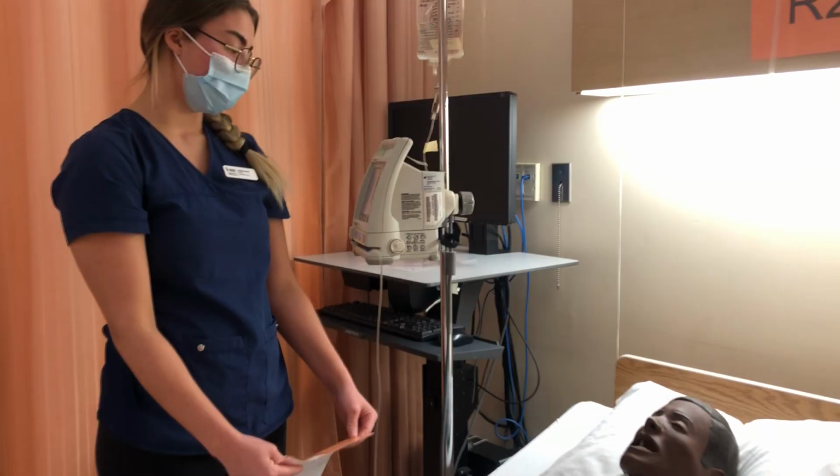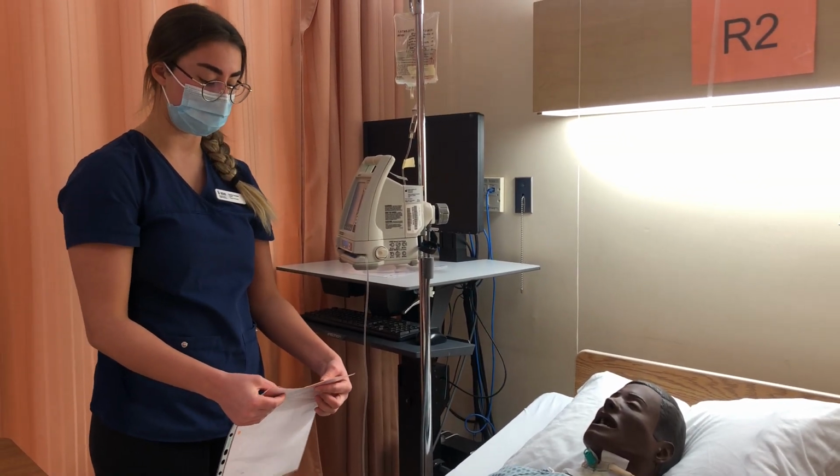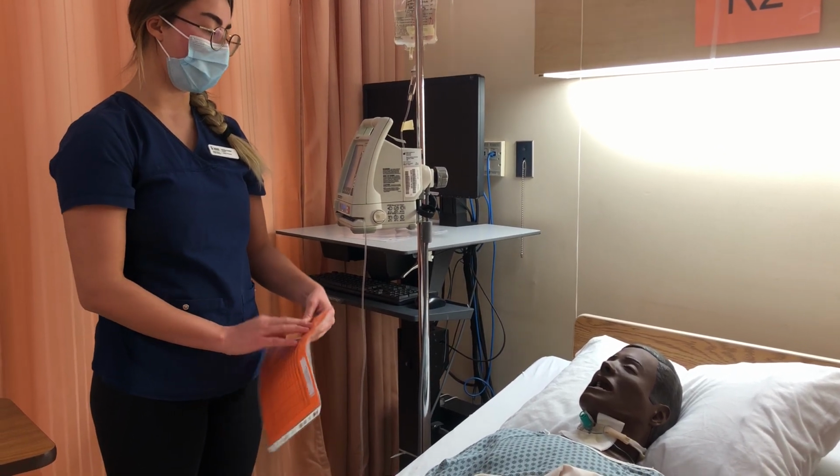Can you tell me your first and last name? They say Benicio Vines. Can you tell me your birthday? They say August 1st, 1963. And do you have any allergies? They say no. Great, that all matches my MAR.